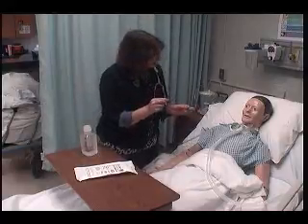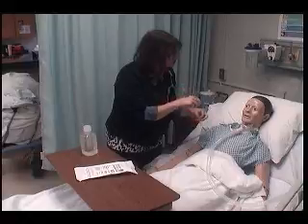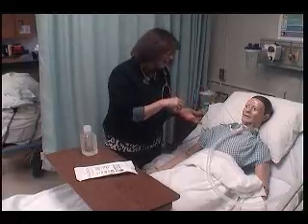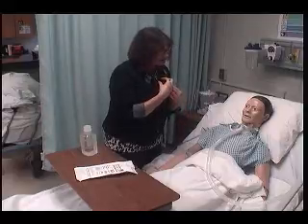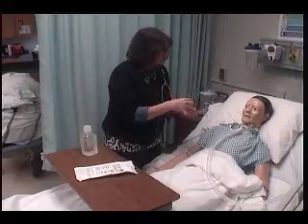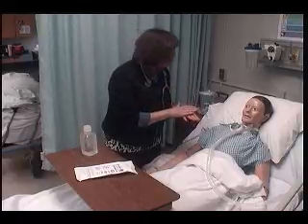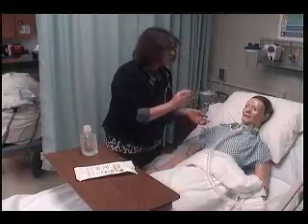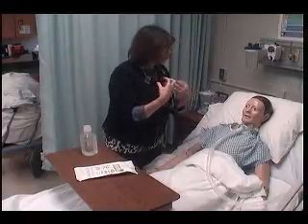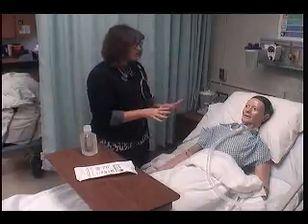'Sir, what I'm going to do is I'm going to use a little catheter, go right down your trachea, and help you cough up some of those secretions — pull some of those out. It's not really painful, but it is uncomfortable. I'm going to have you get some oxygen beforehand, but it will feel like I'm taking away some of your breath. It won't be for very long and it will help you breathe better because I know you're having a hard time with those secretions and with breathing right now.' So he understands what I'm going to do.